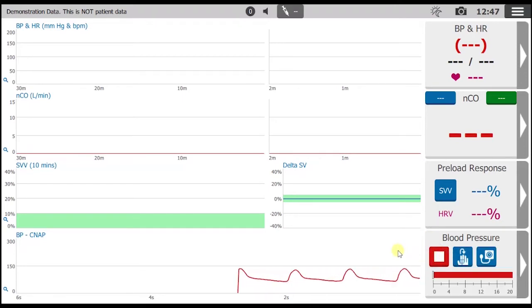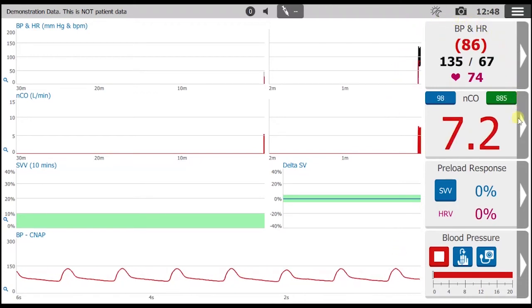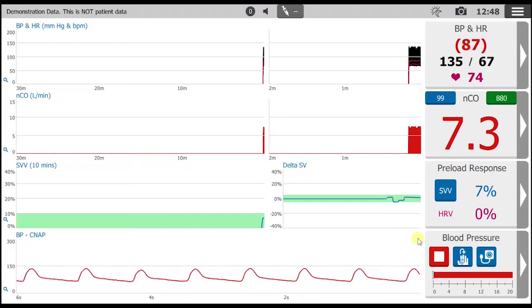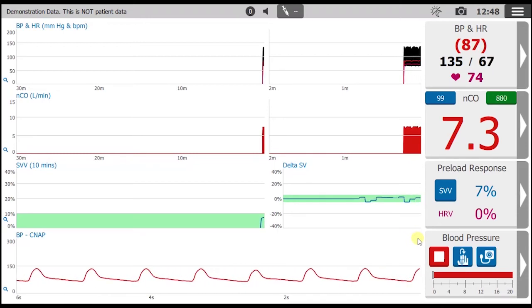Through the magic of an internal simulator, numerics are immediately presented. The actual signal acquisition process usually takes only about 90 seconds, and you can watch it happen live, but that's a different video.